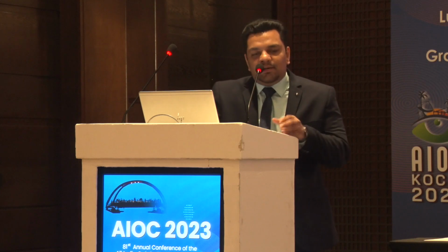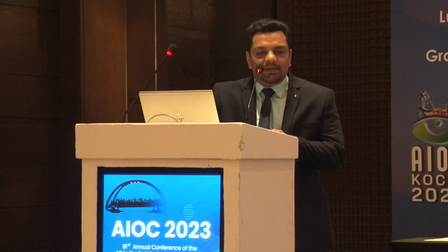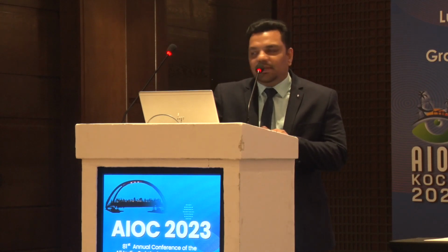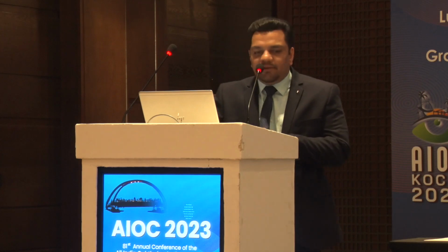If you want, you can do a SICS wound, open up the tunnel, or you can just go in with your 3.2 millimeter keratome, and then through the cornea itself, you can put the 3-piece IOL. So I do a small superior section, do a proper anterior vitrectomy, remove the remnants of the bag, and then I do a proper core vitrectomy, make sure no vitreous is there. I don't induce PVD, but I just do a proper core vitrectomy.